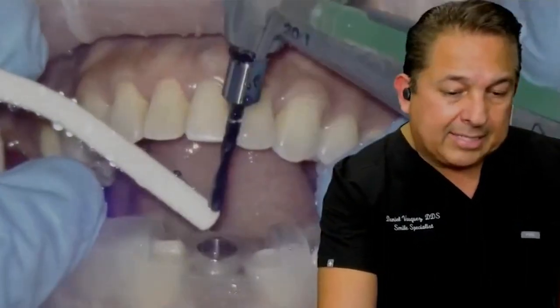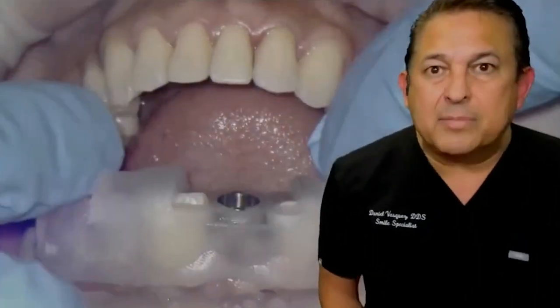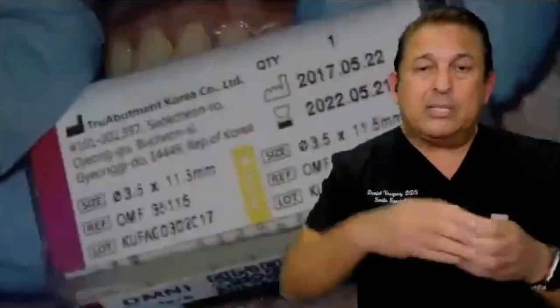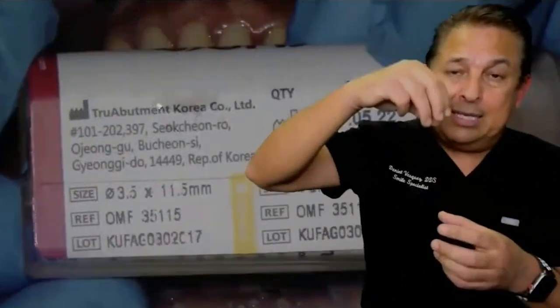And let's move forward. Now we already finished the osteotomy. And we're going to place the implant through the surgical guide. And this is a guided implant placement, so we know precisely where the implant's going to be. So the internal hex is going to be positioned in the right place. So when we place the abutment, it's going to fit perfectly fine, okay?